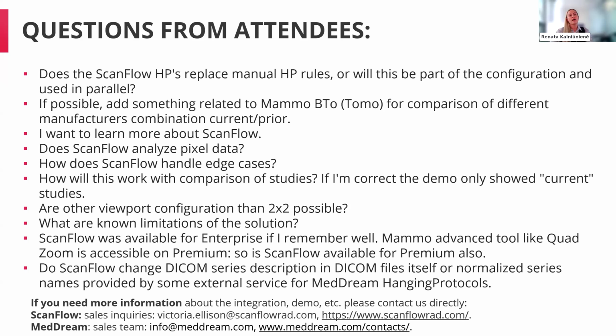Okay, thank you. The next one. How does ScanFlow handle edge cases? Another great question, and one we get a lot. During our implementation phase, we create an institution-specific medical library of all the expected DICOM metadata specific to their scanners and their workflows. So this significantly reduces edge cases from the start. But whenever there is an edge case that breaks a radiologist protocol, we immediately update our institution-specific library so that edge case will be correctly hung moving forward. So it's a very fluid situation, and we're very aware that edge cases occur all the time for the radiologist.